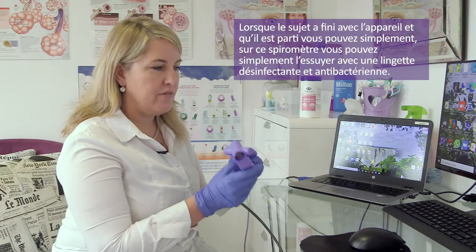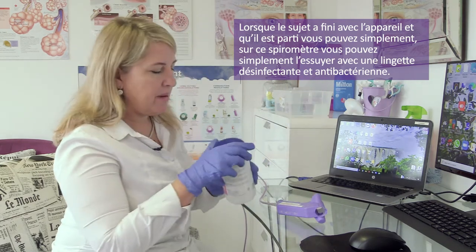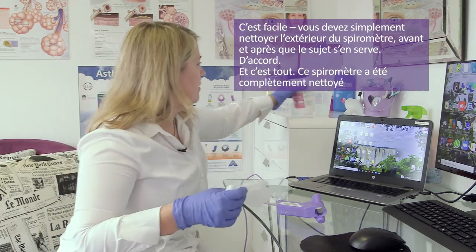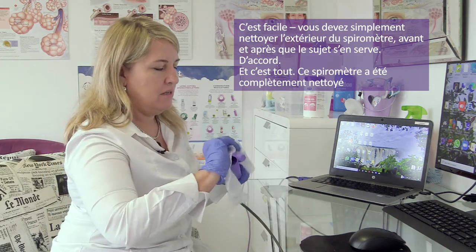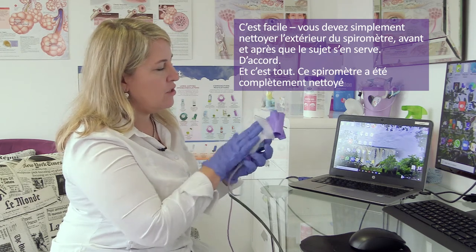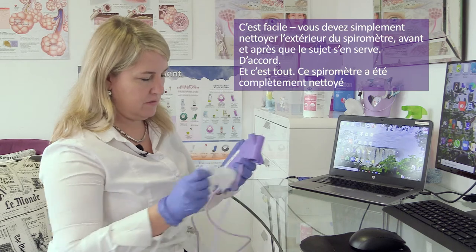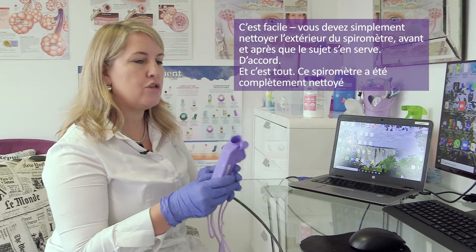When the patient is finished and has left, you can wipe down this spirometer with an antibacterial wipe — very simply. All you have to do is clean the outer part of the spirometer. You would clean it before and after the patient actually blows.